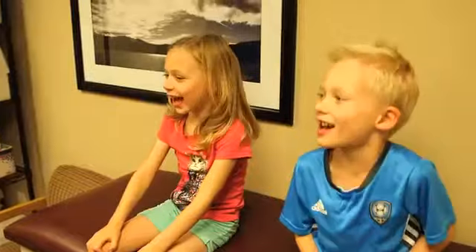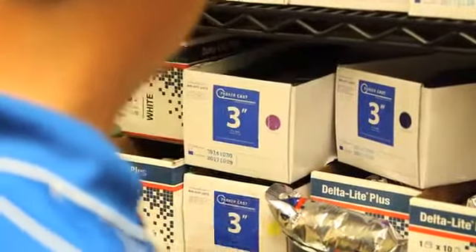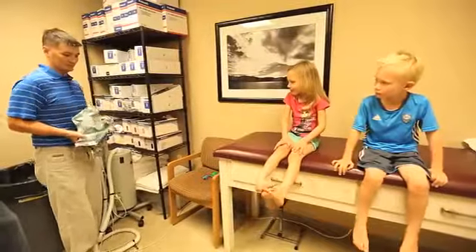Okay, so you guys ready to see how easy it is to get a cast? What color are we going with? Blue and pink. A lot of people find getting a cast put on or taken off scary, but once they realize what it really is, it's pretty simple. So the first thing we're going to put on here is a giant sock.